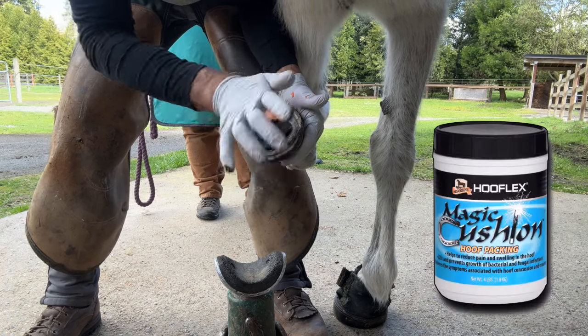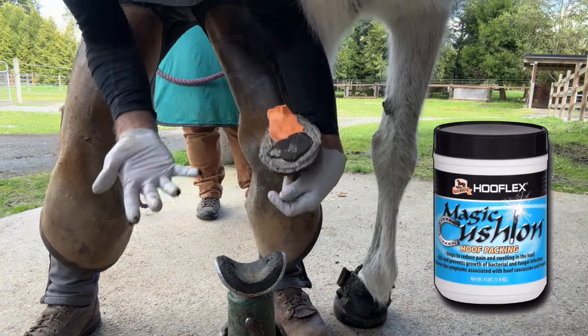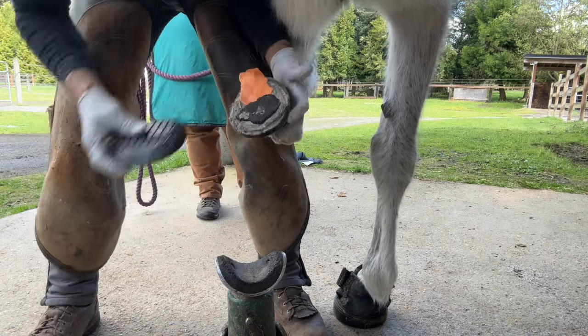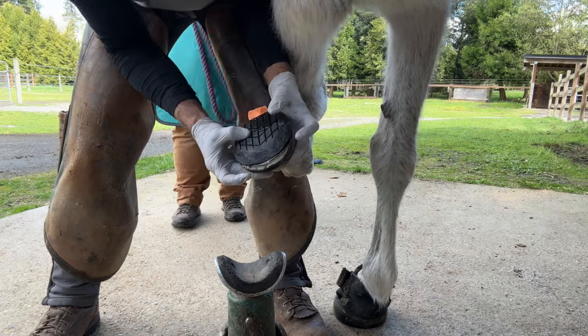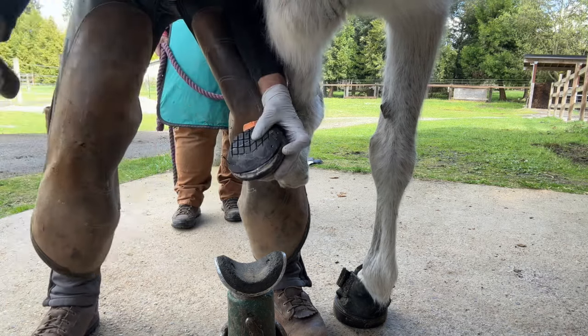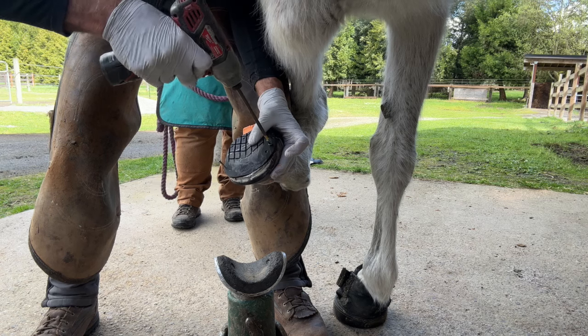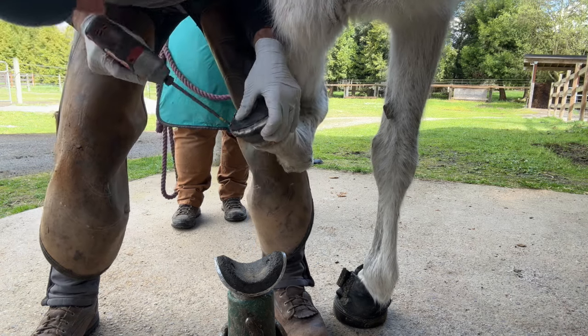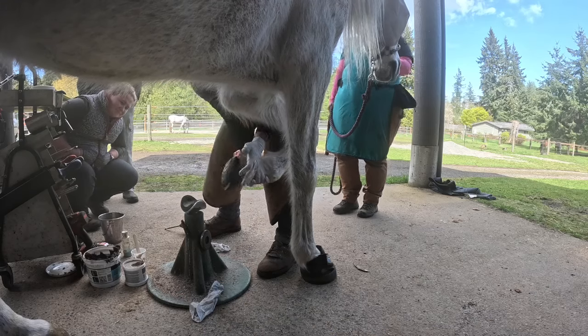Then I use Magic Cushion. Magic Cushion has a lot of benefits of turpentine, iodine. It's got ground up leather in it. And this helps in areas where I don't want any firm packing, but I want to be able to help toughen up the bottom of the sole. Once again, I'm going to use my set screws to help hold the clog in place.